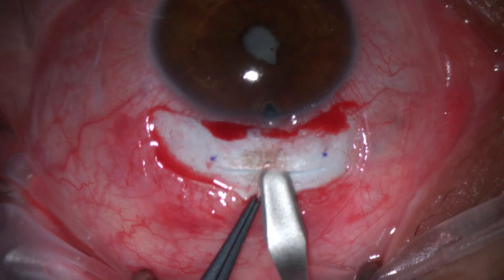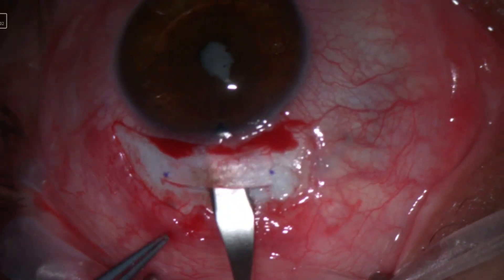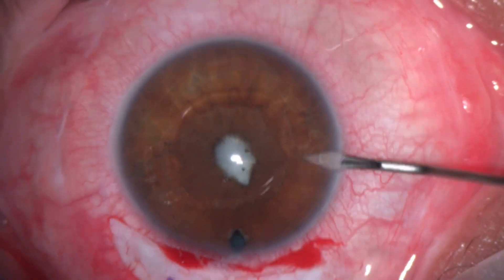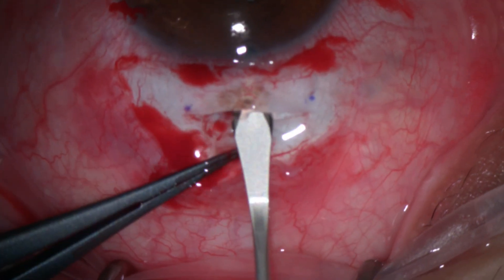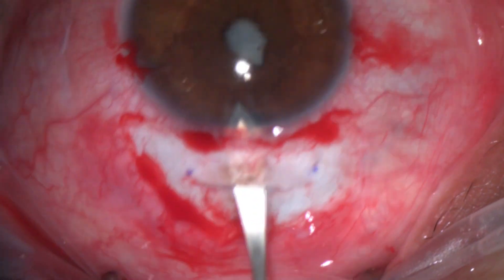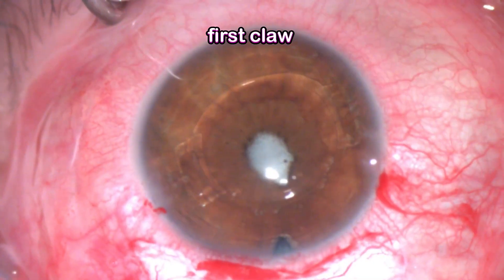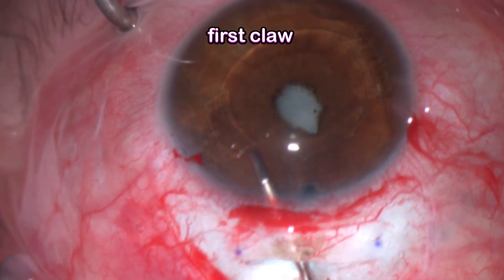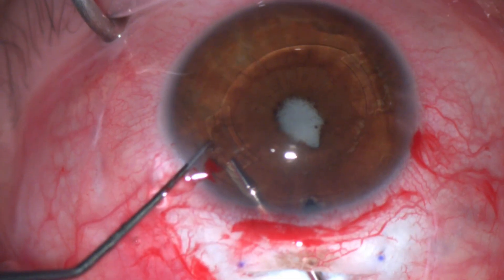I planned a slightly posterior scleral tunnel incision, about 2 to 2.5 millimeters from the limbus. After creating the incision I made two paracenteses, then made the initial opening to the anterior chamber. We start the surgery by planning to remove the iris claw lens — I often find it easier to remove it with two instruments.